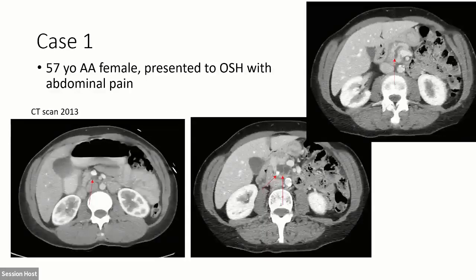Oops, I went back the wrong way. So what I'm seeing now is that the cystic lesion had actually grown a lot. Now the pancreas has some pretty significant ductal dilation. The pancreatic duct is about 6 millimeters or so, and she has this big stone stuck right in the front portion of the pancreatic duct. So I sent her for endoscopic ultrasound, and we do all of the appropriate things.